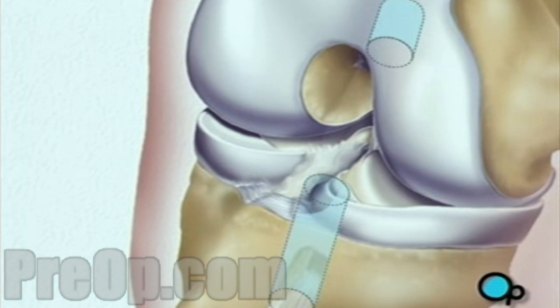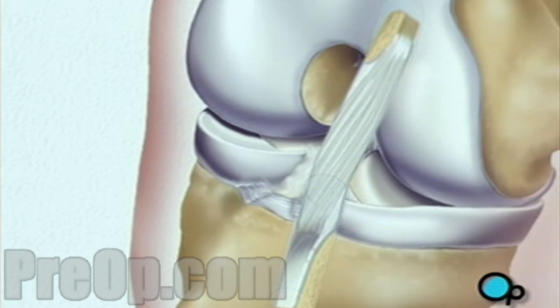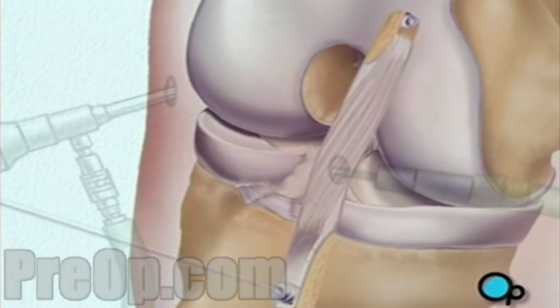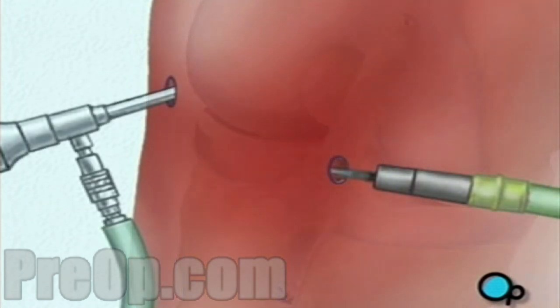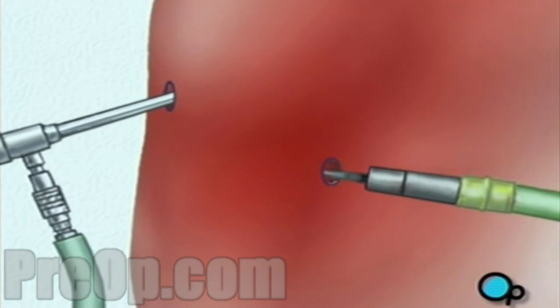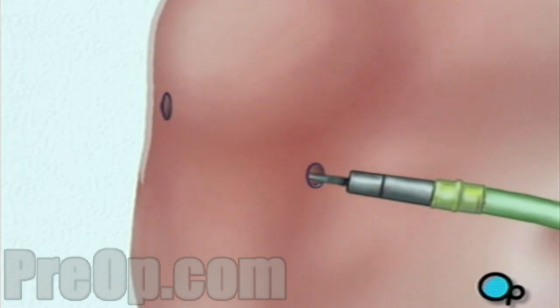The ligament graft is then inserted into place. When the procedure is complete, the team withdraws the instruments and the surgical fluid drains safely from the knee.